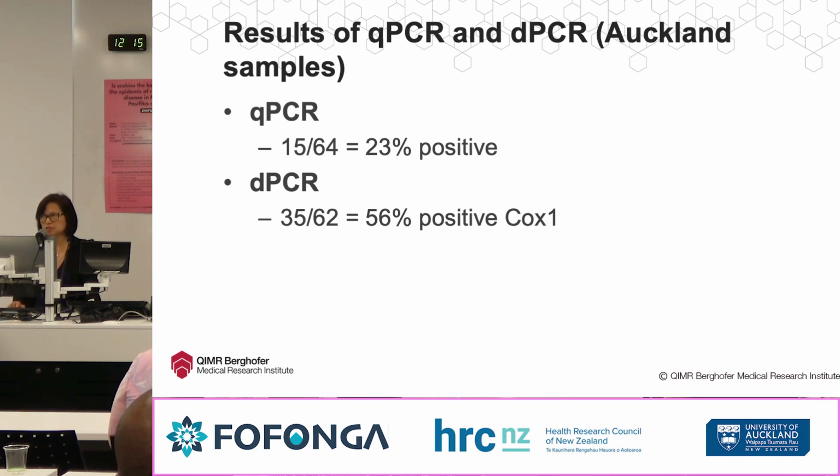That they've been sending us. So my role is just to really provide a real definitive diagnosis, and I always run this blind. I don't really know the clinical details, how they single out. They just send me samples. So this is a blind assay using the latest technology.